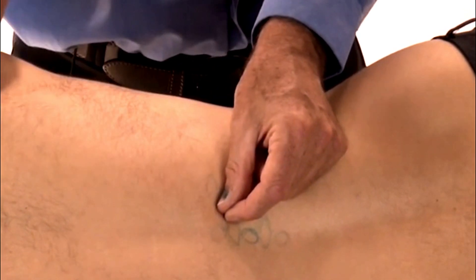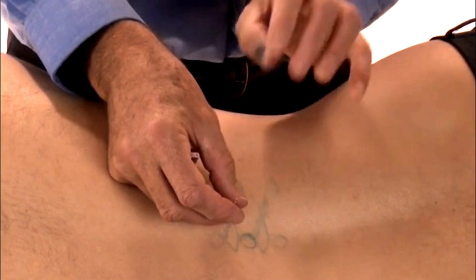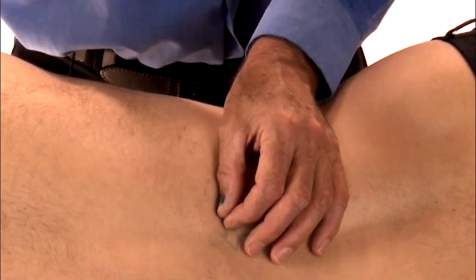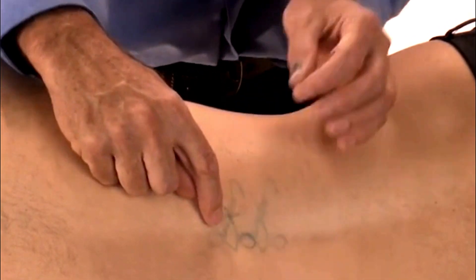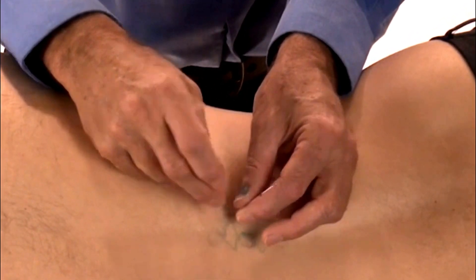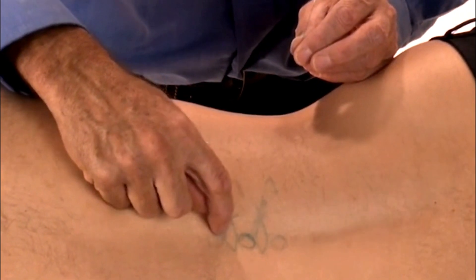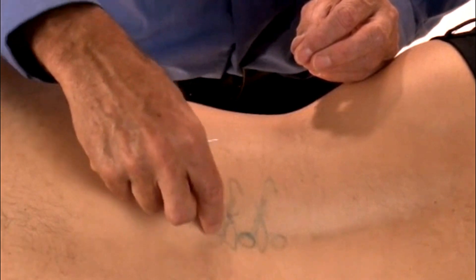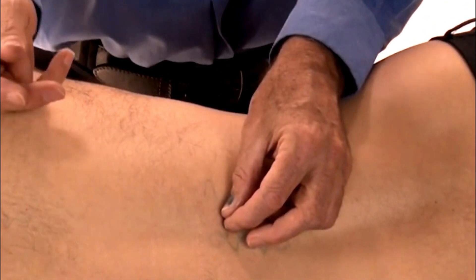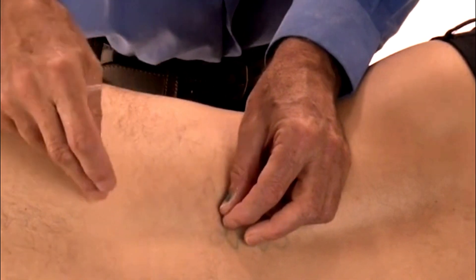The moment he says 'ouch,' or I may feel the needle jump — the muscle twitch underneath my hands — the moment I'm there, I stop. The multifidus sits just above the bone, so it may well be that as you strike bone, the patient says 'ouch,' meaning you've just entered the little multifidus as it runs across the articular pillars of the vertebrae. Once it's there, you leave it, give it a little twist, and leave it for 10 to 15 minutes. You can treat as many as need treating.